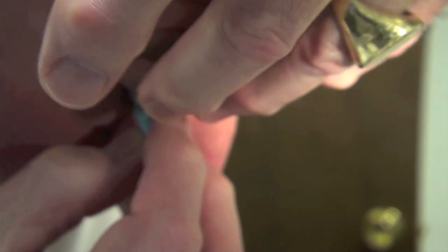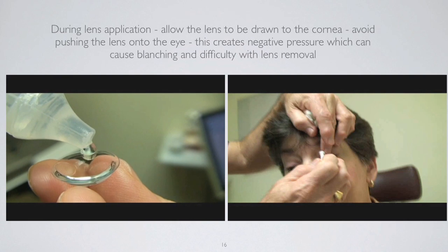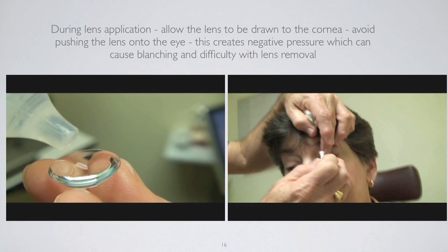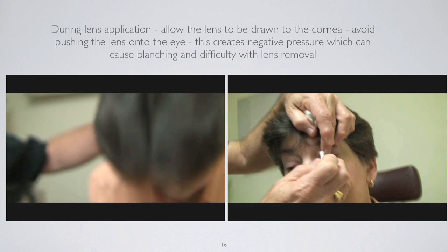We don't want to increase discomfort in any way, so applying and removing the lens is something you really should practice before you start working with your first patient. Here I have a patient and I'm going to apply the lens. When I initially started fitting lenses, I would put fluorescein in with the saline when fitting the patient — it does help to be able to see the fit. Here I'm filling the lens again with non-preserved sterile saline and dipping a fluorescein strip to get some fluorescence of the fluid layer.